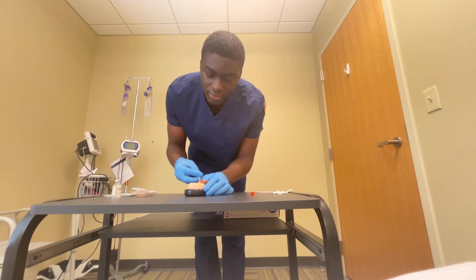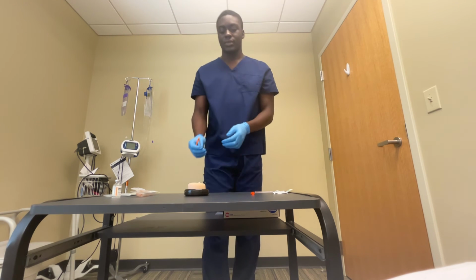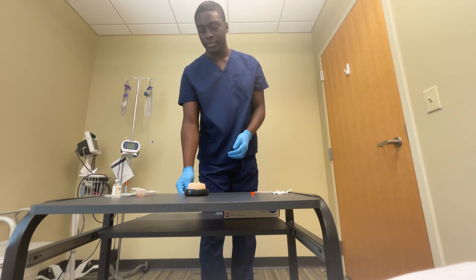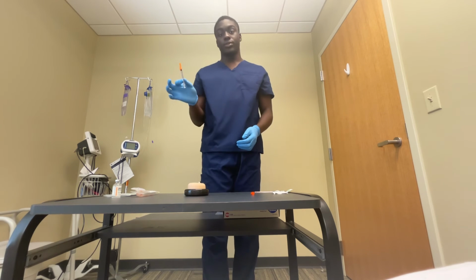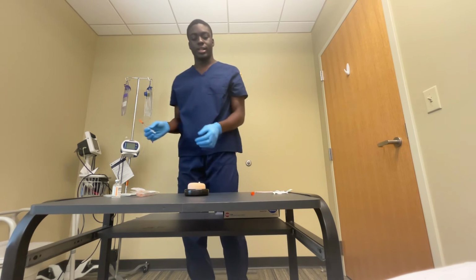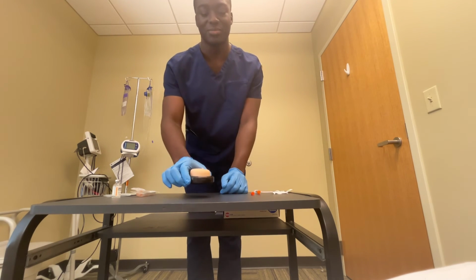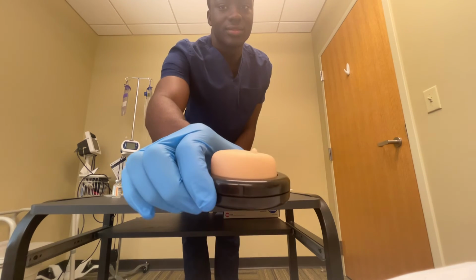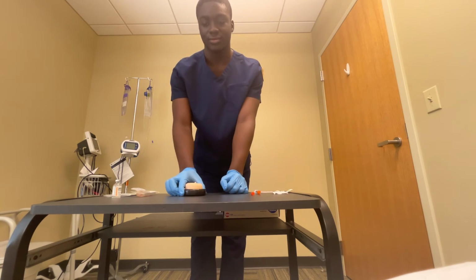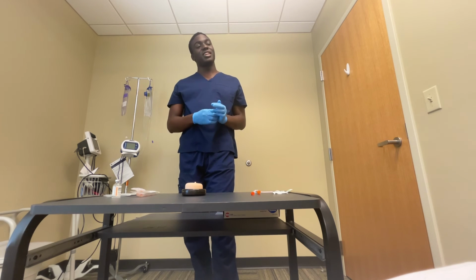Remove the needle. Instruct my patient to not put pressure on it or scratch or rub on it. Cap my needle. Throw it into the sharps container. I'm going to show you my injection site. Hopefully it doesn't bust. And then I'll tell my patient, do not rub or scratch at the injection site.